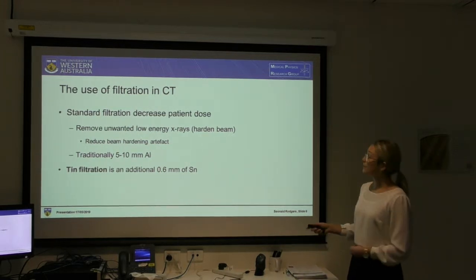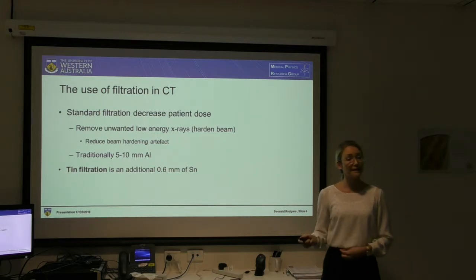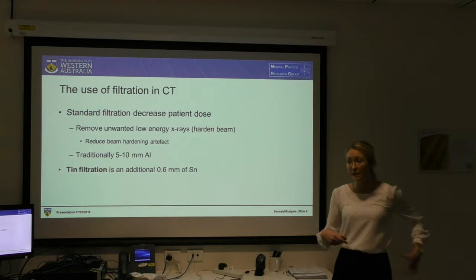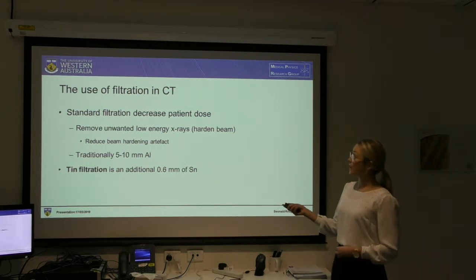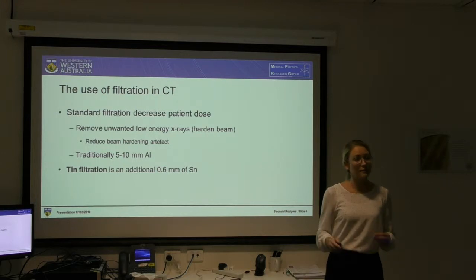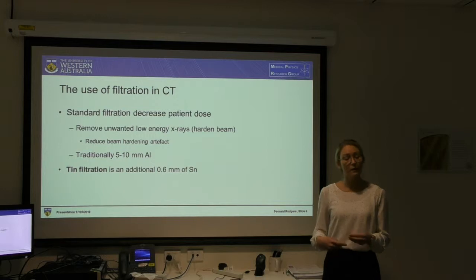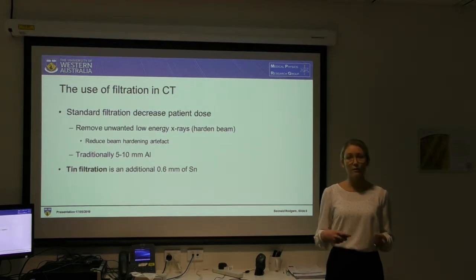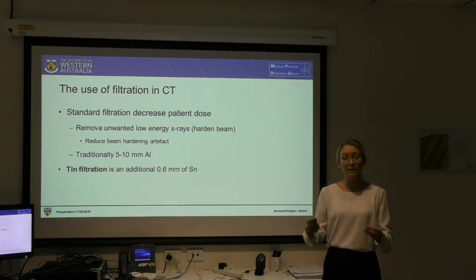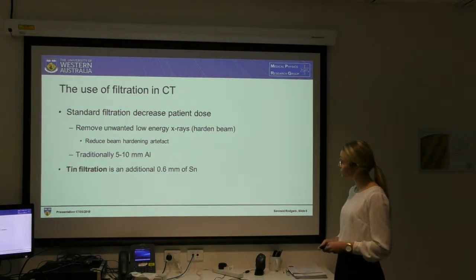Traditionally, a standard amount of filtration in CT is used to decrease unnecessary patient dose, especially to the skin. The filtration reduces the very low energy X-rays that do not reach the detector and are instead absorbed by the patient. They do not contribute to the production of the image, but they do contribute to the patient's radiation dose.